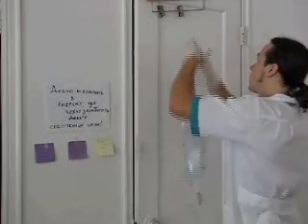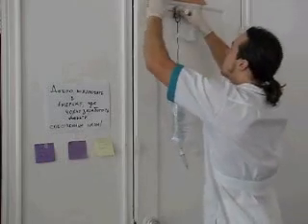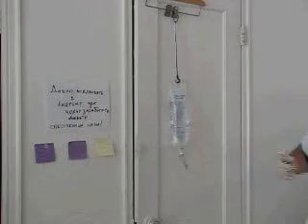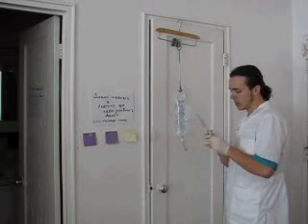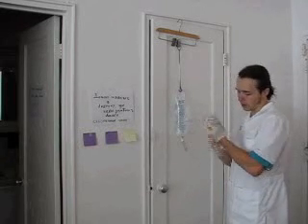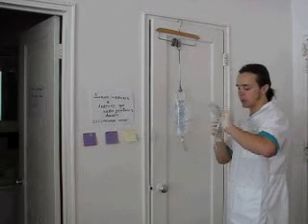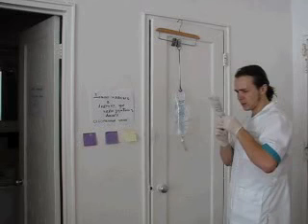Then we're going to lower the line. Once we lower it, we're going to take the infusion. The next step — we're going to close the roller clamp. Now, check the expiration date and clarity. This is fine.